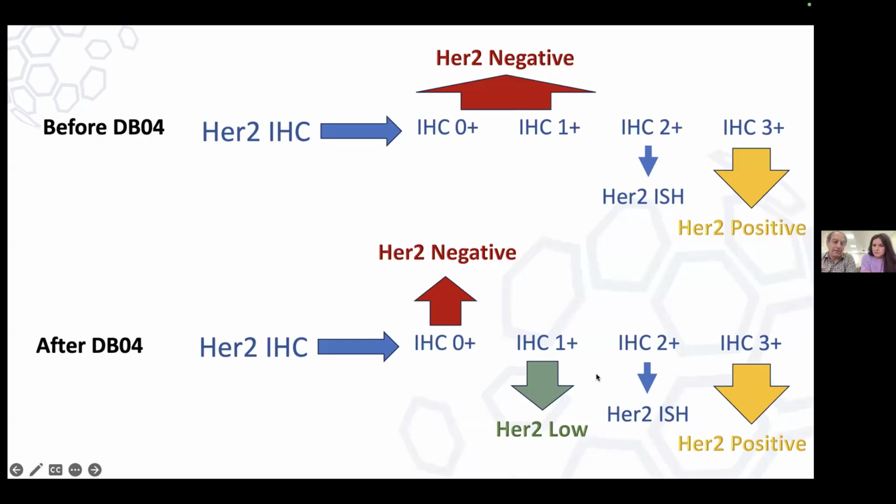And hasn't been robust because some people started to analyze diagnoses made 10 years before, where we weren't aware of these differences. And they said, oh, we're all over the place between 0 plus and 1 plus. But that was unrealistic. But when we then test the pathologist population to try and distinguish better 1 plus to 0, we realized that we are not very good.